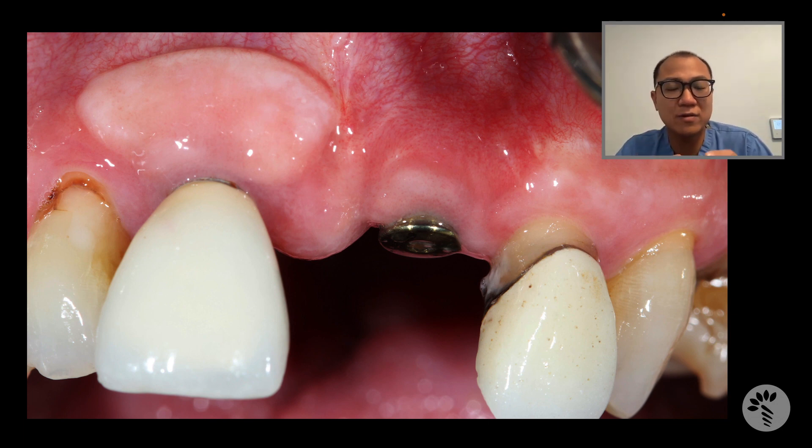You can clearly see that there is a free gingival graft that was augmented. The reason for that was that when this implant was done 10 years ago, over time he actually developed gingival recession, which caused showing off the metal abutment. This happens a lot when the soft tissue surrounding the implant is extremely thin.